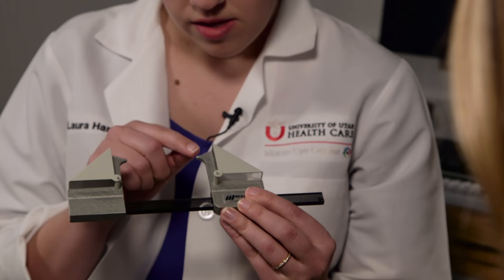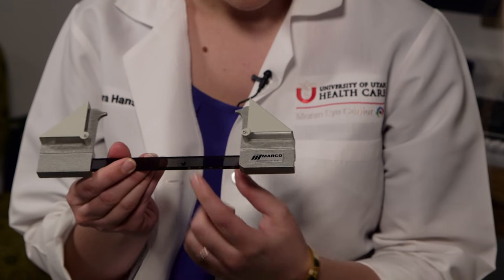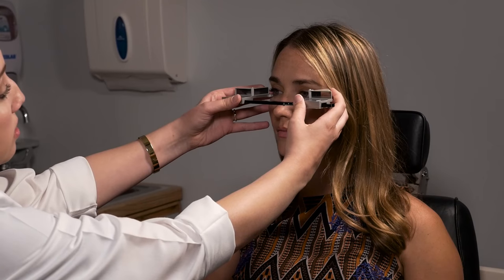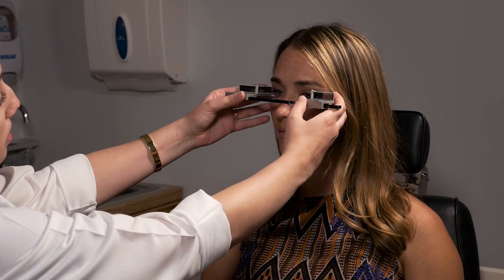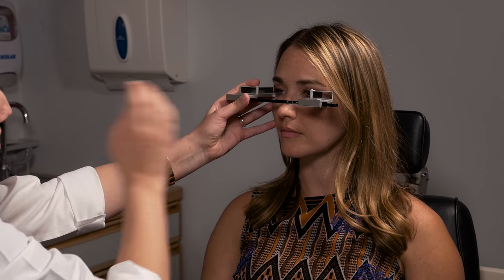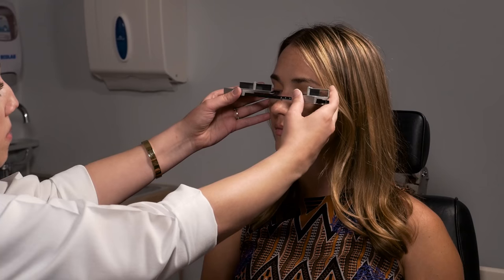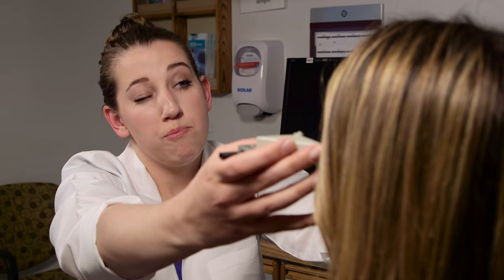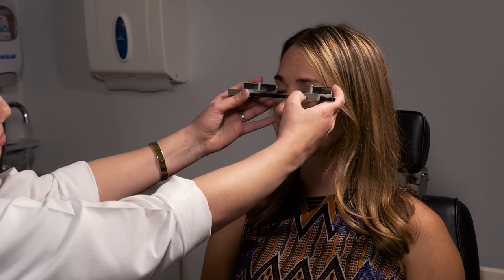Now I'm going to show you how the neuro-ophthalmologist uses the Hertel exophthalmometer to measure the position of the globe within the orbit. These are the index points, these are the mirrors, and this is the ruler you use to measure the base. You take the index points and place them just inside the temporal orbital rim, slightly inferiorly to the lateral canthus. You close one eye, look in the mirror, and you'll see two red lines — the point of the red lines is to eliminate parallax. You line those up, look at the corneal apex, and mark where it falls. Always note the base measurement — the distance between the two index points.